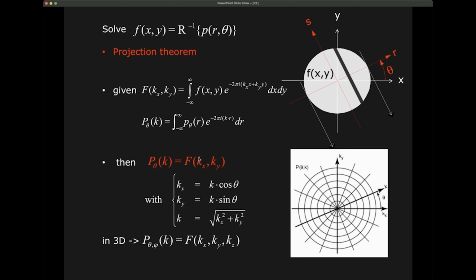And so that means that we can do image reconstruction by using Fourier transforms and inverse Fourier transforms. And this is exactly what is mostly used for CT. As I said before, we're going to go into more detail in the practica. So we're going to see how this works, but this is the basic principle.